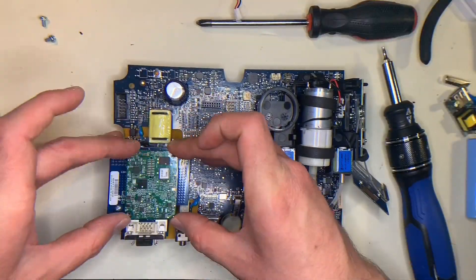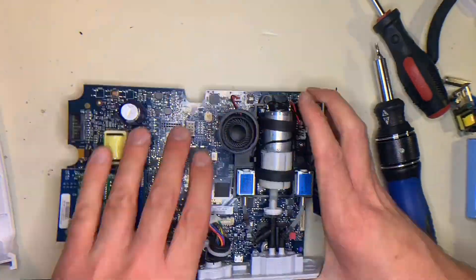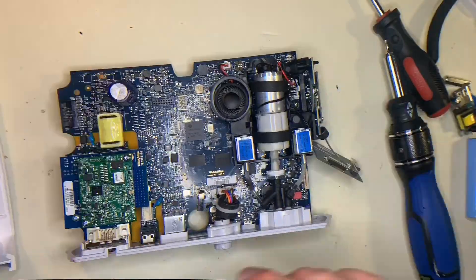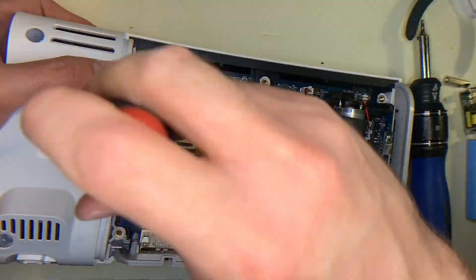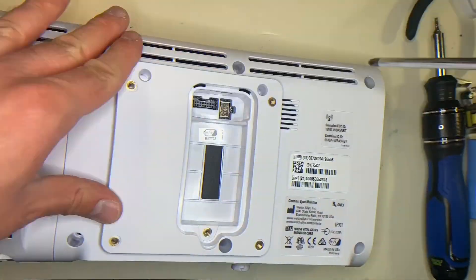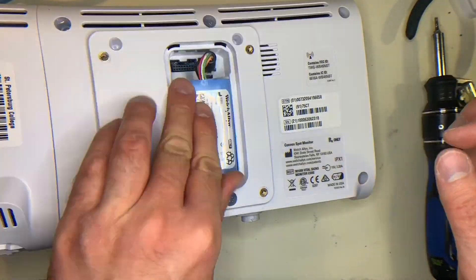Putting it back together is basically just repeating the steps in reverse. One thing to pay attention to when reassembling is the flat flex connector that you had to lift the shroud out to put back in — that can sometimes pop out if you're trying to reassemble it. So if you've reassembled it and the button doesn't work or the lights don't turn on, check that ribbon cable to make sure it's on there right.